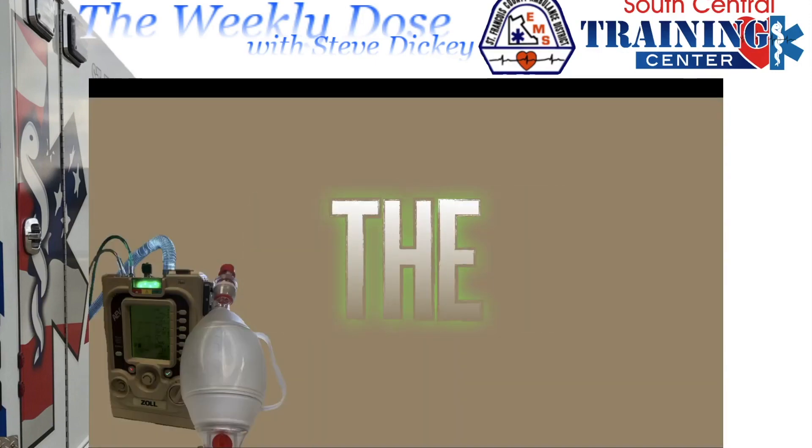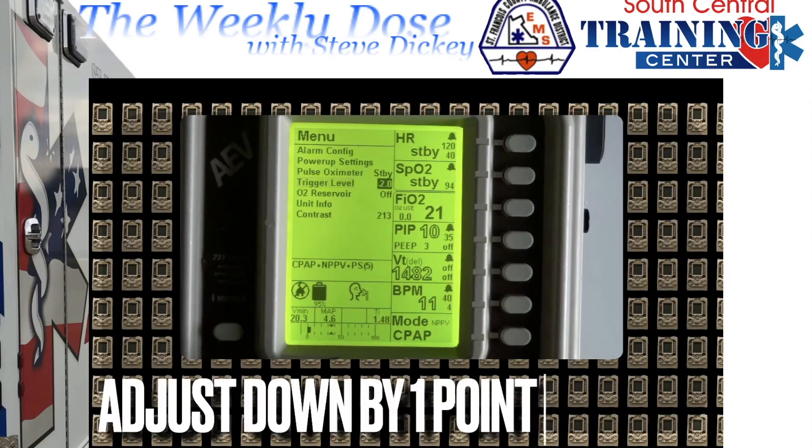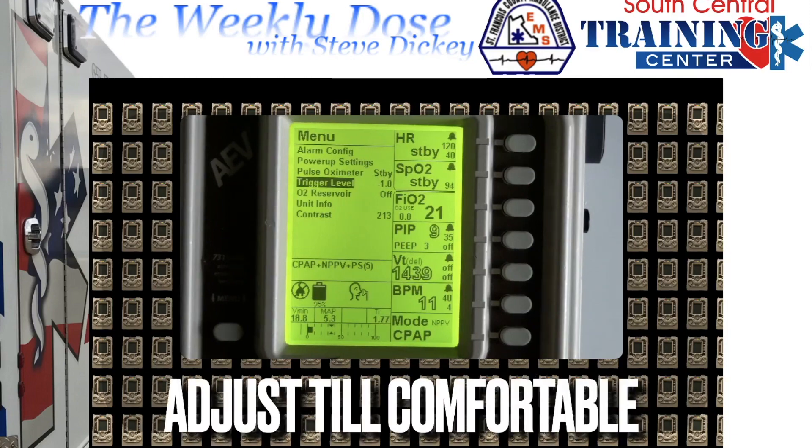Not any better? Adjust the trigger. The default setting is 2. Adjust by one value at a time — the lowest value is 0.5 — until they're comfortable. The trigger is actually a negative number, but it may be easier to think of as a positive when adjusting. When I say adjust down, adjust it closer to 0.5 to make it more sensitive, and closer to 6 to make it least sensitive. If they're starving for air, adjust that number closer to 0.5.